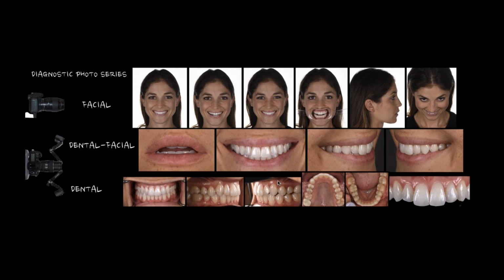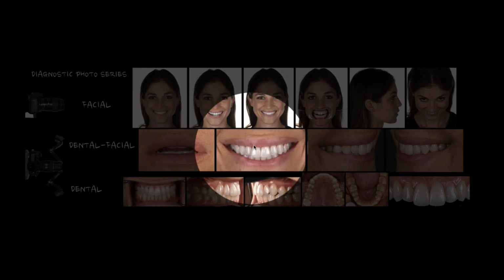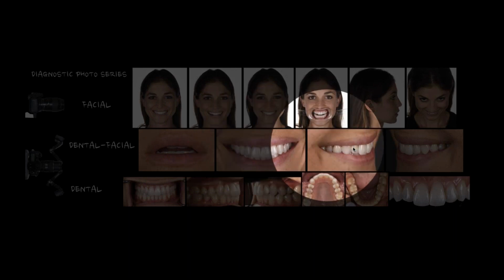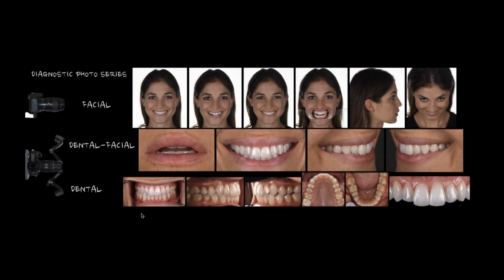After the head photographs, we're going to move into the dental type or the white shots. And this is the repose photograph. So a patient is basically relaxed and we're looking at where their incisal edge display is. Big smile, so I can see where their teeth are and what the planes look like, and then left and right photographs.